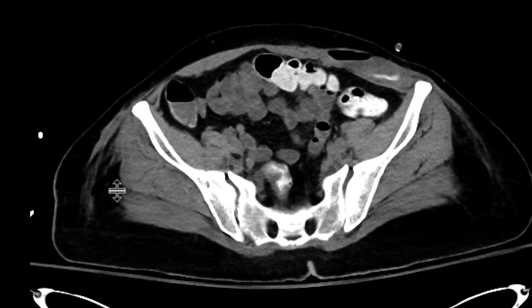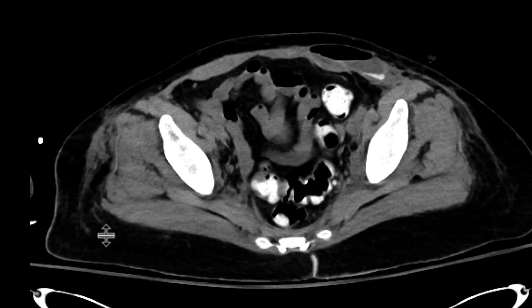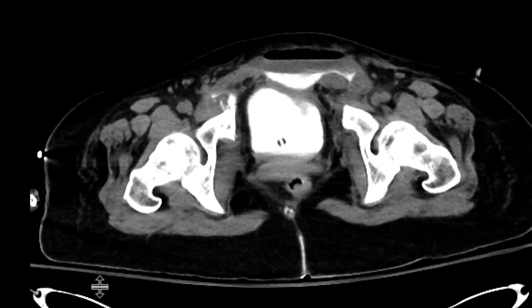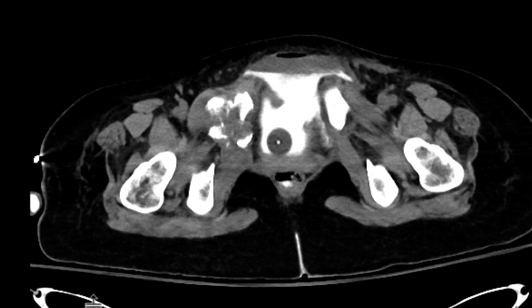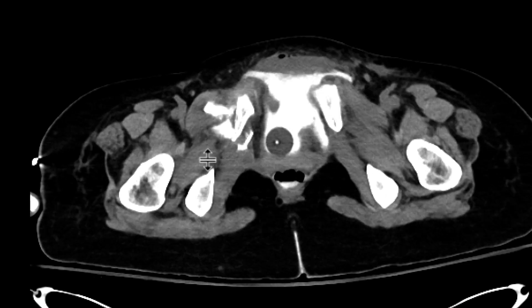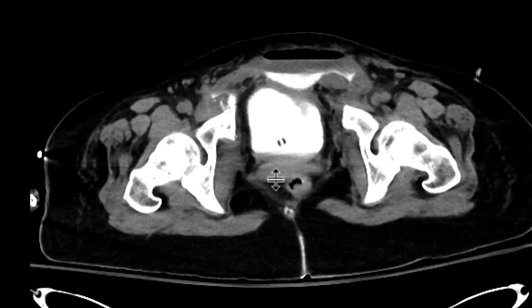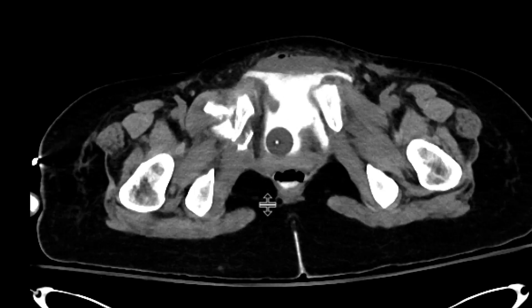Subsequently, we give contrast through that Foley catheter. We can see that while it does fill the bladder, there's this very big defect within the bladder wall, and out from that, all that urine and contrast is pouring outwards.